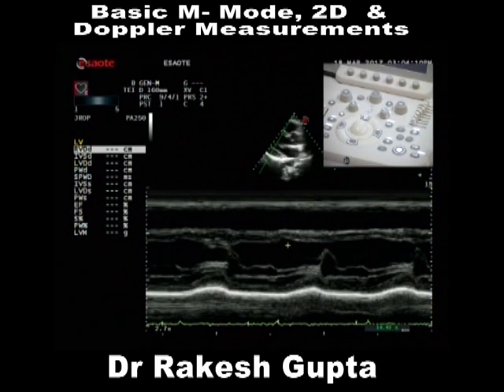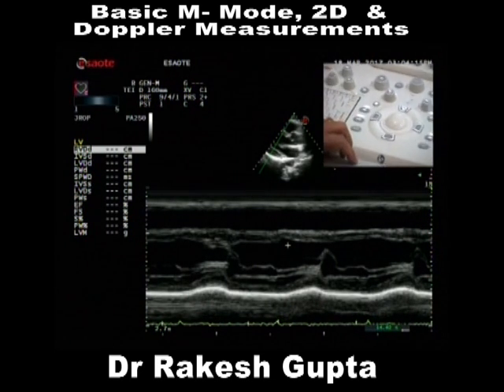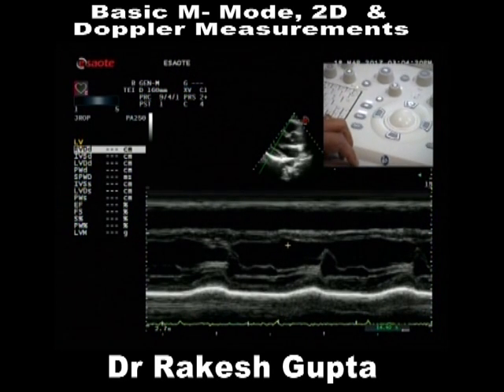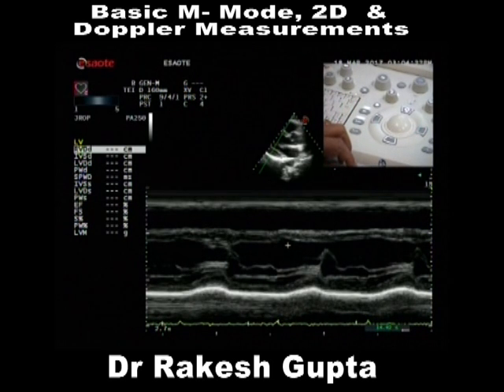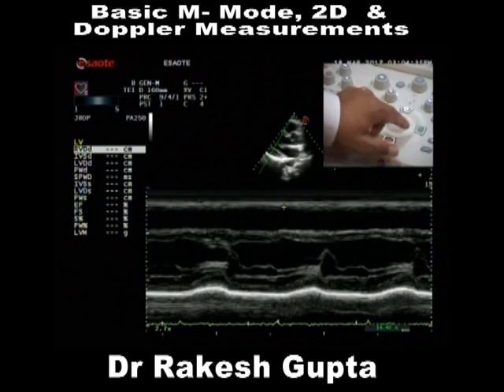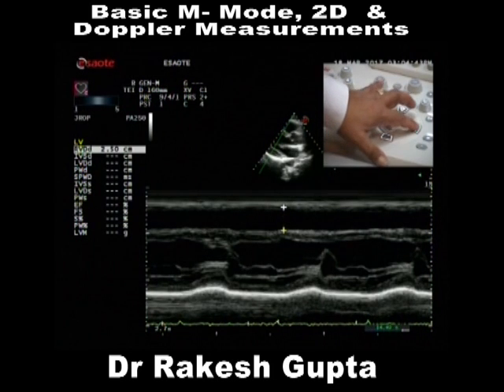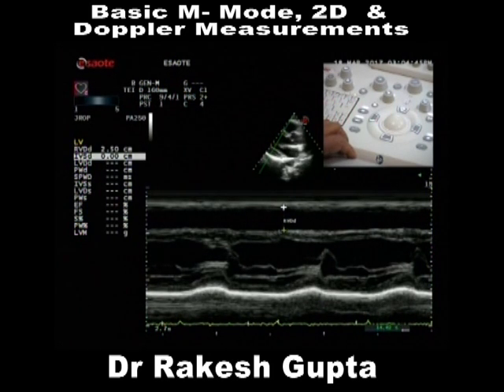Good. In this, I have used the measure key. As soon as you measure right ventricular diastole dimensions, where is the right ventricular diastole dimension? Here or here? Same as RV dimensions, same as LV dimensions. So I am going to scroll to this point. I will say enter. Now I am pushing the enter button. Now it will come down to this is RV dimensions, 25.